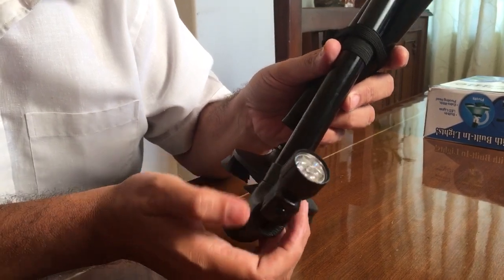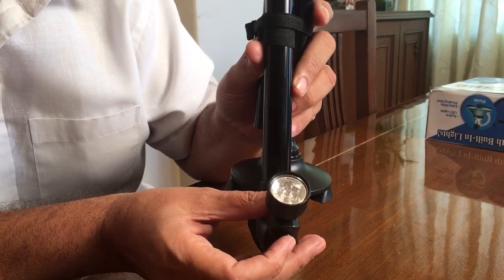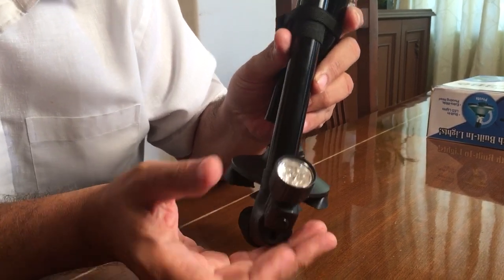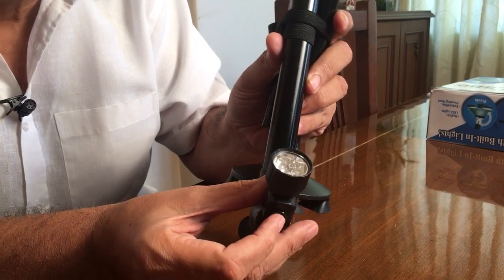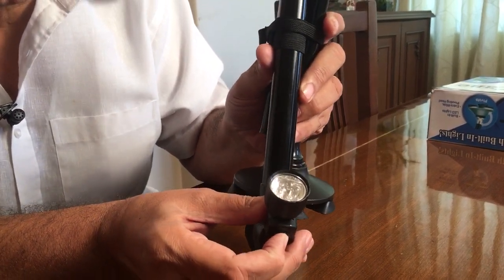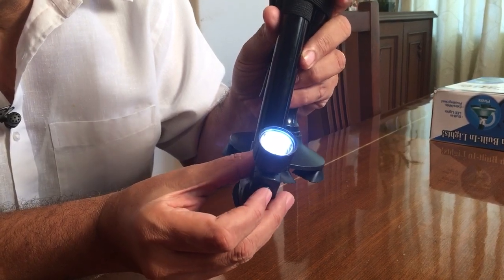For an elder, this becomes a very good feature, especially when the elder has to open a door and requires a flashlight for looking at the keyhole.